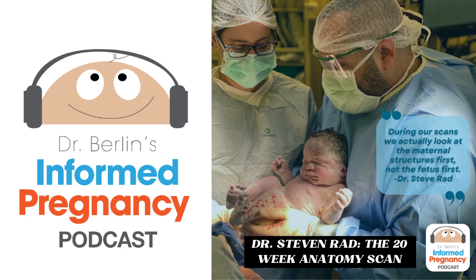So first of all, you come in, you go to the doctor's office or a fetal center, you check in, and you go to an ultrasound suite or room or lab, whatever they like to call it. And you are going to be laying in bed, usually on your back, flat. And there will be an ultrasound machine, usually to your right. And in front of you, typically fetal centers have a screen, a monitor, projector, or if you get fancy on the roof, up top, you can see what the sonographer or physician scanning you can see.